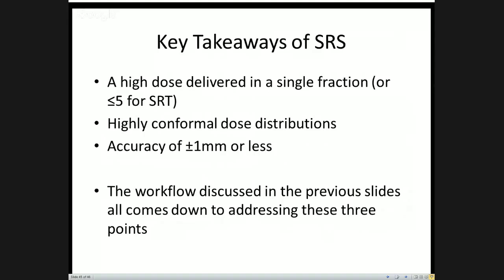So the radiobiology of SRS versus hyperfractionation. Again, we're assuming that everything that we contour in that target is cancerous disease. Fractionation helps particularly when we have normal tissue that's mixed in, so an actual primary treatment. In that case, we are taking advantage of the fact that oftentimes the healthy tissue can repair better than the cancerous tissue.